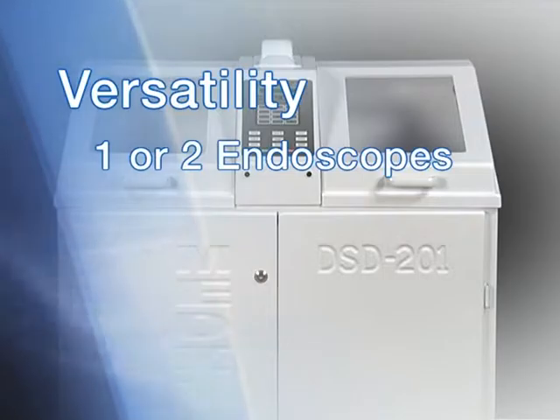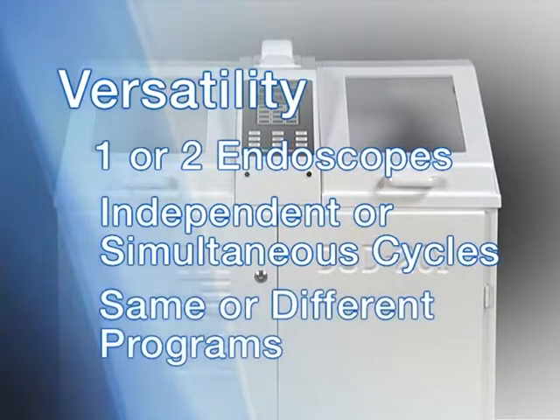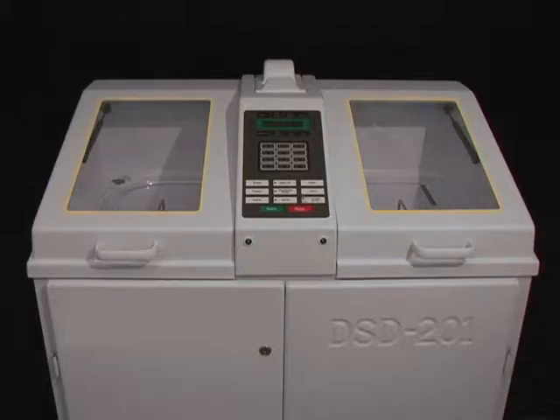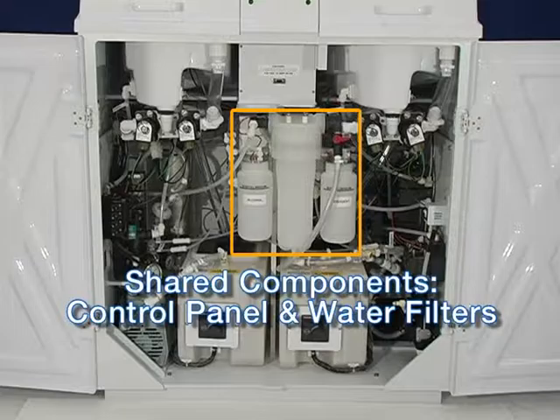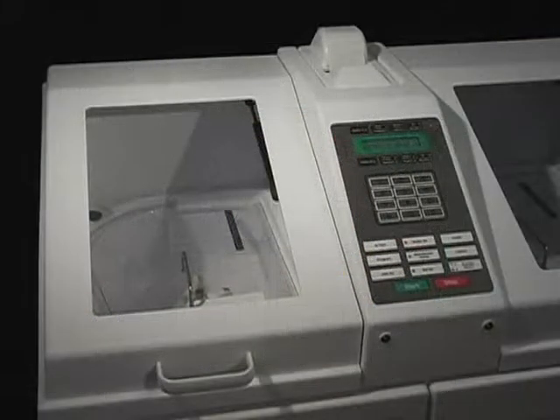The DSD-201 is a dual-scope disinfector. Two endoscopes can be reprocessed simultaneously or asynchronously. The DSD-201 incorporates the best-in-class design and performance for AERs. We know you'll be pleased with this important new addition to your endoscopy suite. The DSD-201 was designed to meet customer needs with four major benefits: safety, versatility, speed, and cost efficiency.